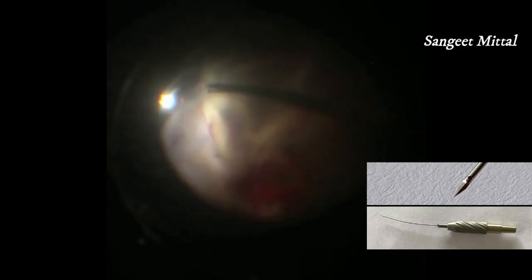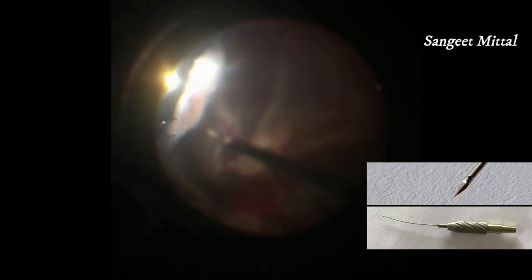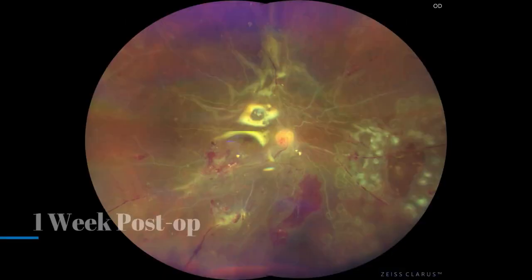Because the dissection is done using a simple to and fro motion, the membrane removal can easily be done by the non-dominant hand also. The long and curved shaft protects the lens and the retina from injury during dissection.